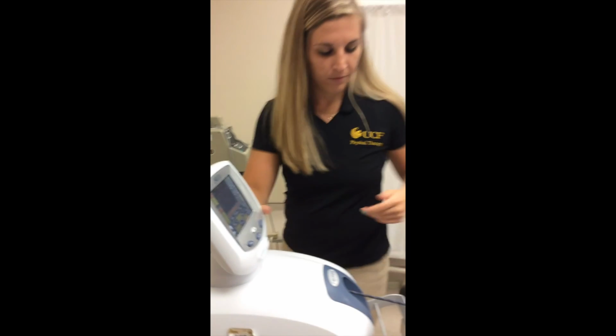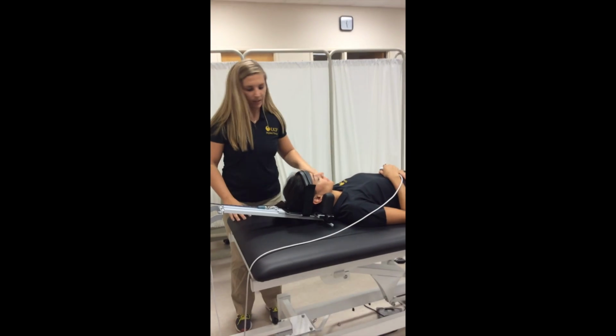And are you ready? Yes. And we can go ahead and start.